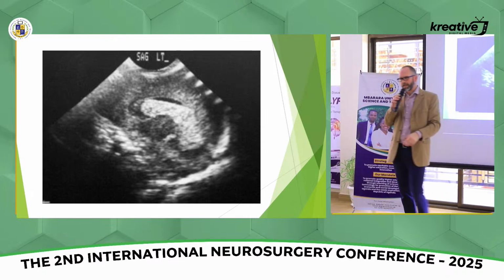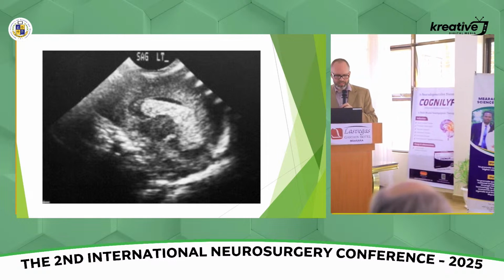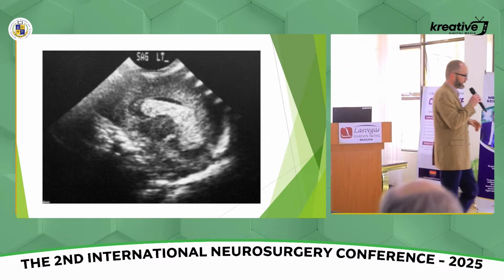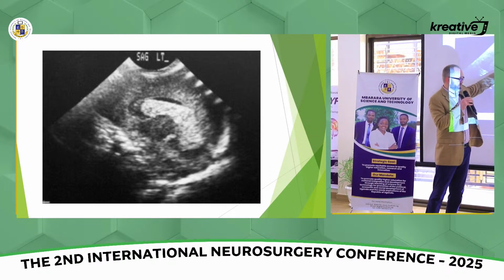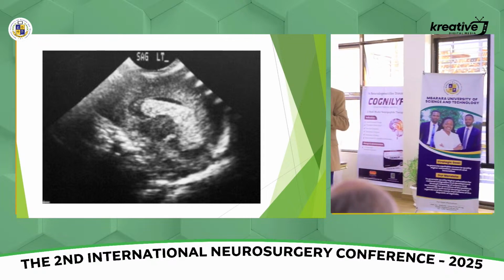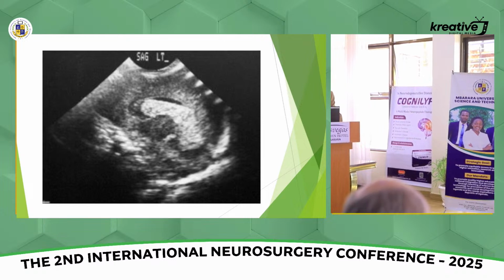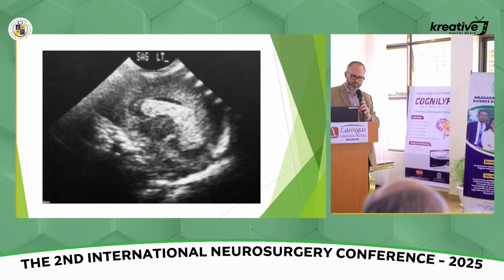And again, acute hemorrhage is bright, quite echogenic. As it becomes more subacute to chronic, it gets darker. Here you can see a fluid level, so this is acute but not completely clotted, or there's a layer of CSF above it. But at any rate, there's a fluid level, so you can appreciate that just like on CT or MR.